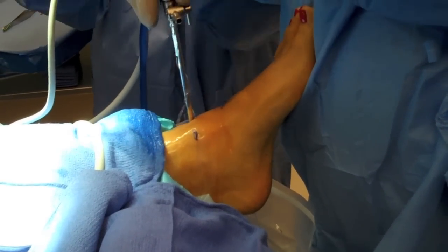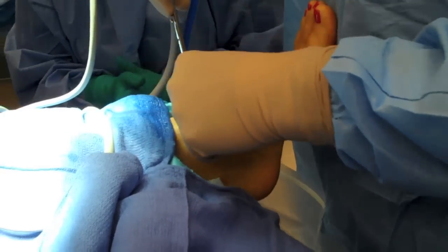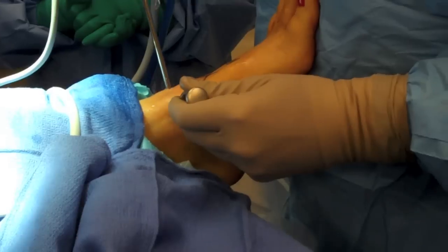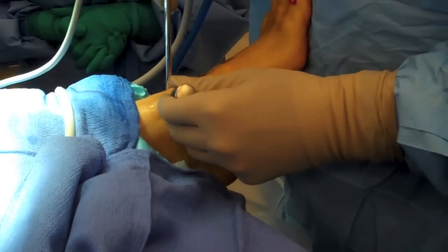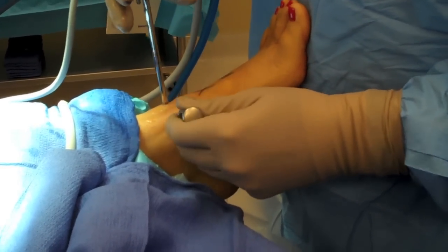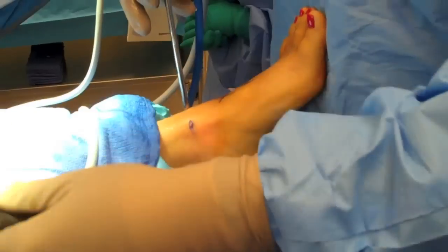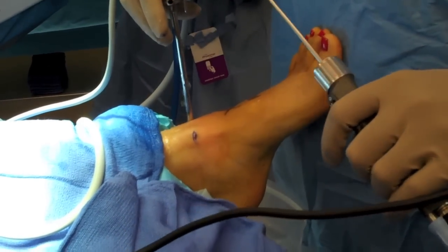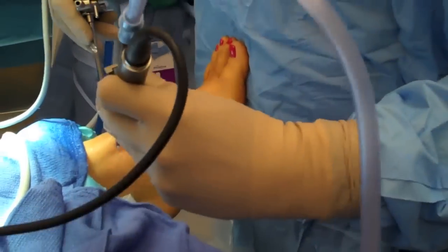An egress portal will be established through the anterior medial side with a small blunt obturator and cannula. Typically I will start my debridement of the joint through the anterior medial portal with a 3.5 full radius shaver. I tend to make my lateral portal under transillumination utilizing the scope and palpation of the anterior lateral shoulder of the talus. Here is a 3.5 full radius shaver attached to suction being utilized to start debriding the joint.